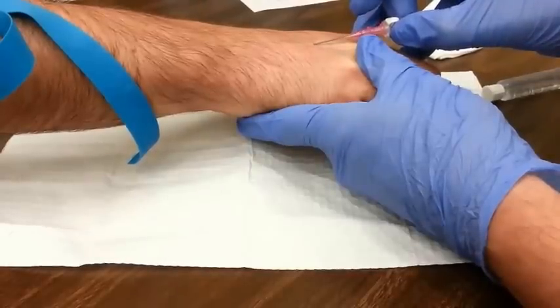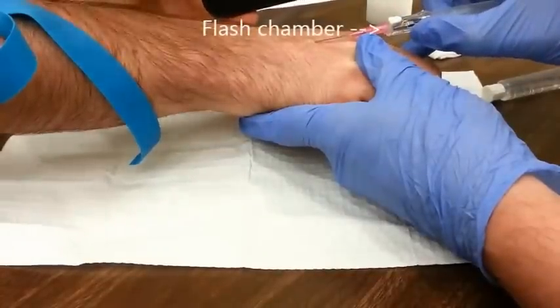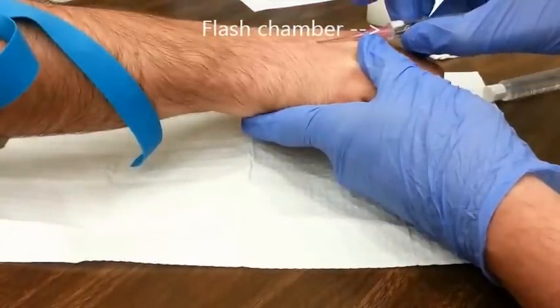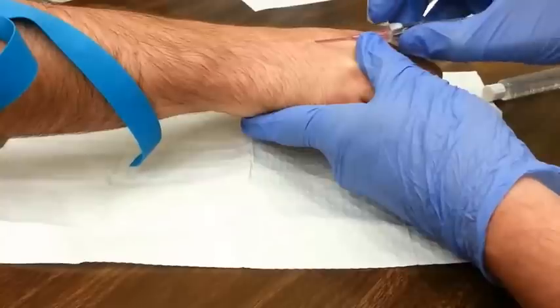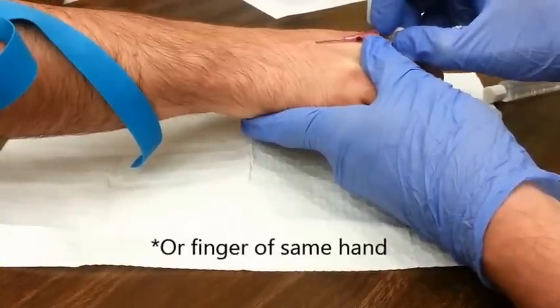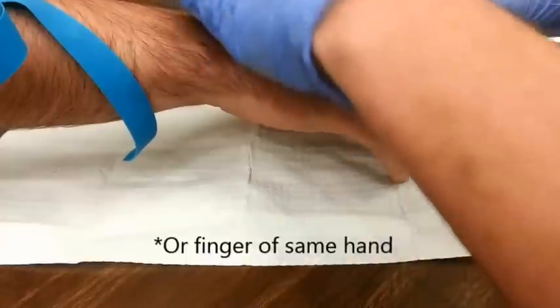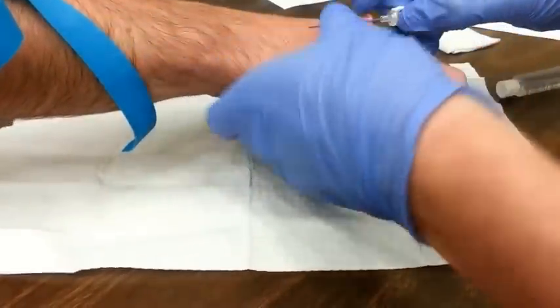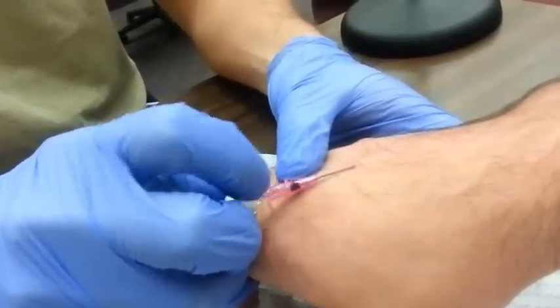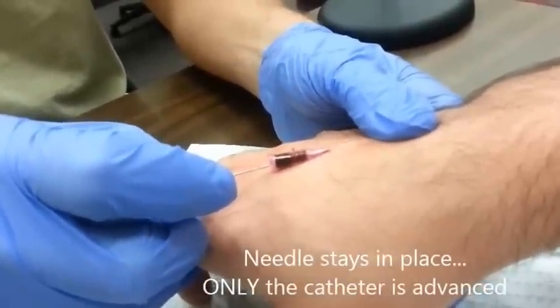Once you hit a vein, there will be a little flash chamber that will fill red. Red is filling the flash chamber, which tells you that you have indeed pierced a vein. If you are in the correct location, your next step is to advance the catheter off of the needle with your opposite hand. Remember not to move the needle — you are advancing just the catheter. Ideally, you would be able to move the catheter all the way up to the skin surface.